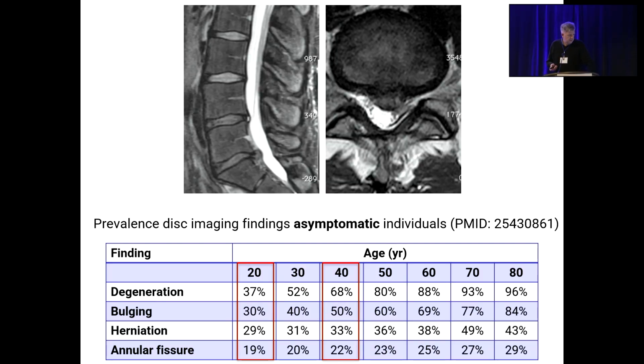And the thing that we should be doing, which some MRI facilities do, but we don't do at UCSF, is put epidemiologic data in the MRI reports. And some of you have probably seen these. They do them at Sutter, for sure, many of the Sutter facilities.